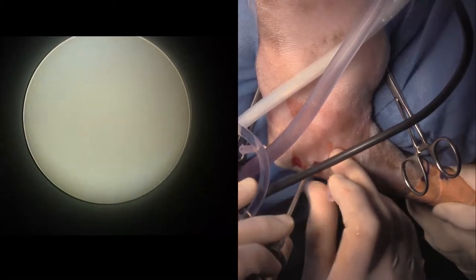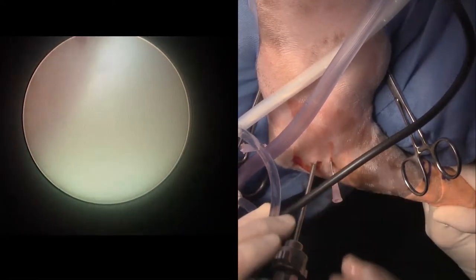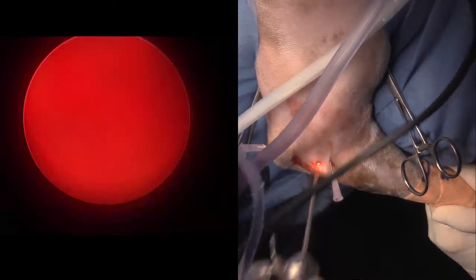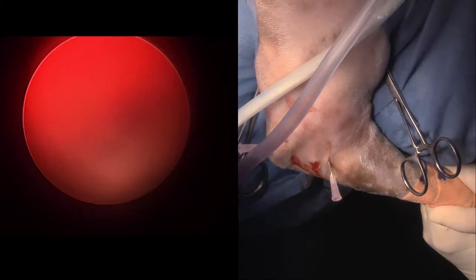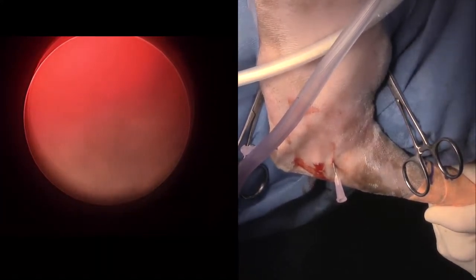So I'm just trying to find my needle in the joint here. I actually have to get a new scope because I cannot see very clearly what's going on here. Can I get a new scope, please? It's a 2.3. I don't think we'll have a 2.3, so I might have to get like a 2.7. Just really squeeze that white valve down right there. Yeah, great, thanks. See if that's clear. So that's all clear, so it means it has to be the scope. Okay, great. Thank you.